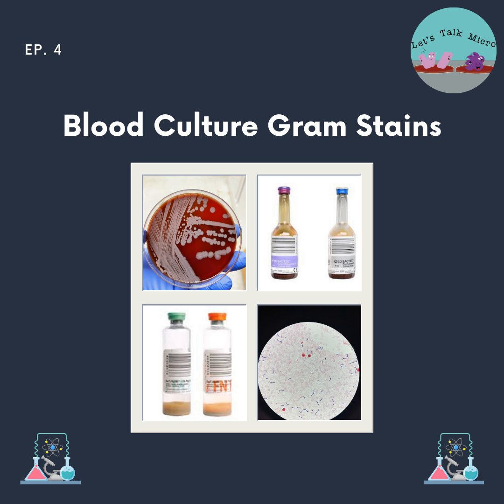Some of these blood culture instruments are very sensitive. And it is due to the fact that some of them limit the amount of times that you can actually open the instrument and have access to the bottles. And I'm going to talk about two systems that have no affiliation to this podcast.